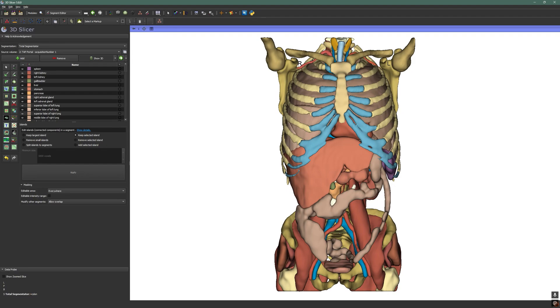Hello everyone and welcome back to the channel. In this video we are going to talk about TotalSegmentator, a tool that has completely changed image segmentation over the past couple of years. It has made almost all of my previous videos on segmentation totally obsolete, but in a good way, because until now segmentation in 3D Slicer required a lot of manual work. Even with semi-automatic tools there was always some tweaking and corrections to do, but now everything is going to be a lot different.